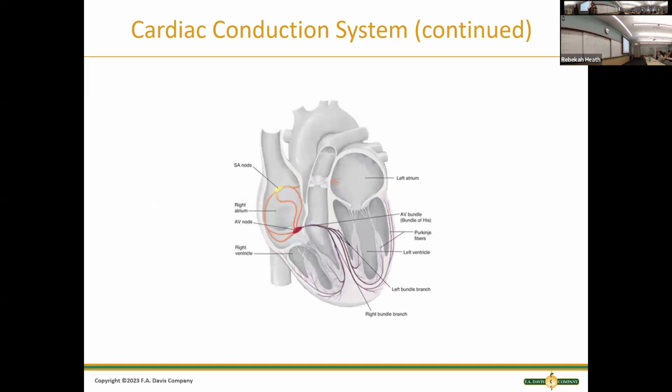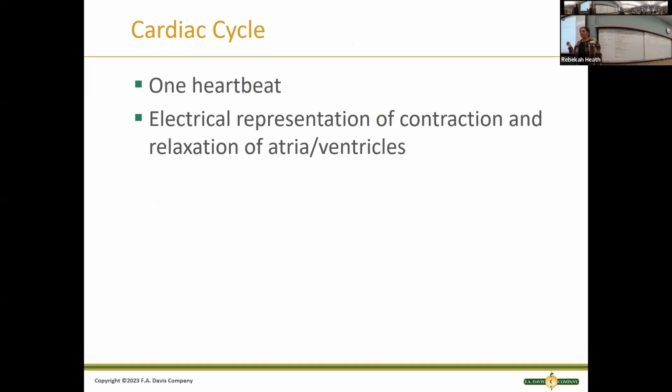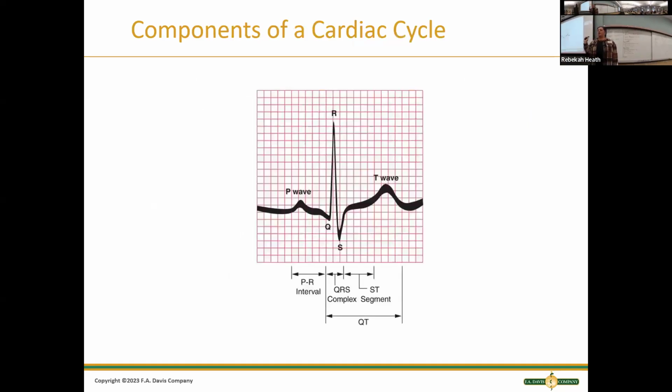All right, we talked about the conduction system and heartbeats. The video talked a bit about the components. So I almost want you guys to get in that mind where you're in the matrix, where you can think through and be like, okay, P wave, atrial; QRS, which is the big whoop, whoop, that's the ventricles doing their thing. And then we have this T wave, and that's the ventricles repolarizing. That's when they're getting ready for the next electrical signal to go through.